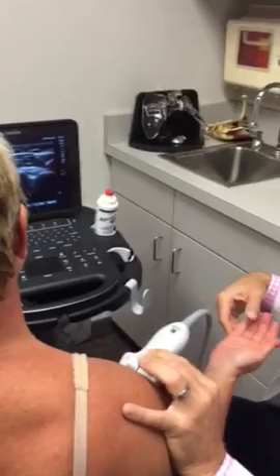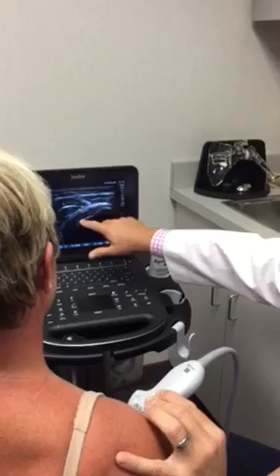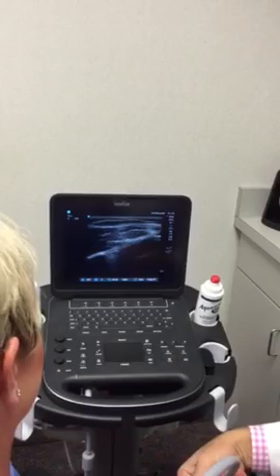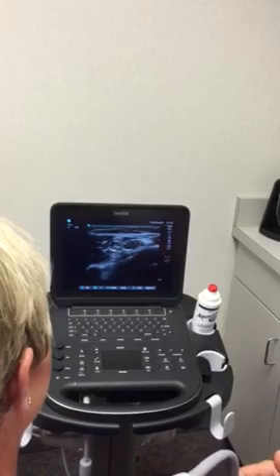With the patient externally rotated, we see in profile the subscapularis tendon inserting into the lesser tuberosity. Probing up, this is the upper cable of the subscapularis. Going medial, this is the coracoid. As you see the patient internally and externally rotate, there's the subscapularis going underneath the coracoid, nice and smooth.